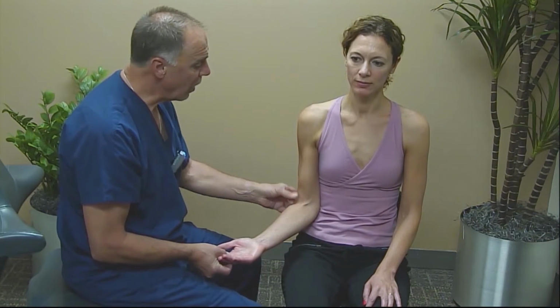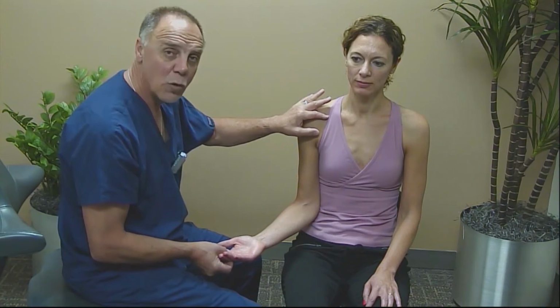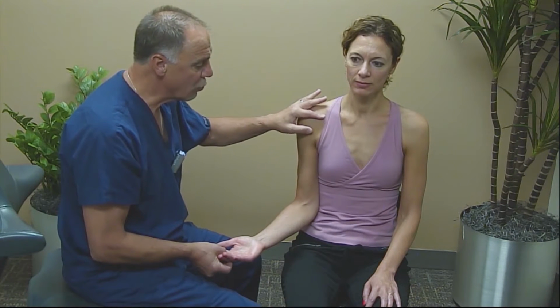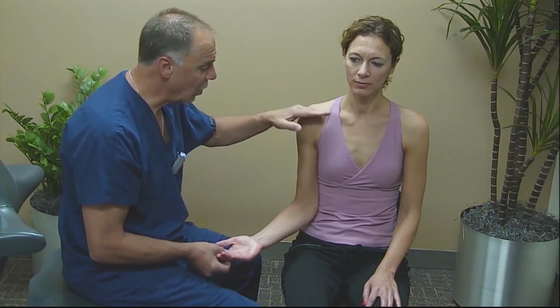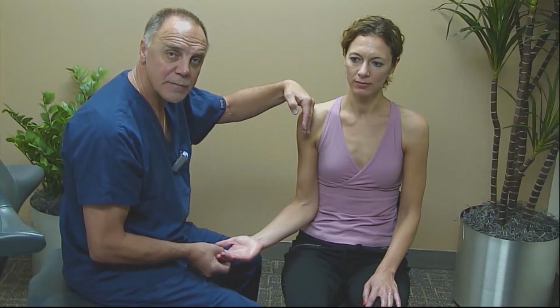This maneuver allows for the subscapularis tendon that is normally hidden underneath the coracoid to be drawn out and give us a window to look at the subscapularis both in its long axis and in the short axis.